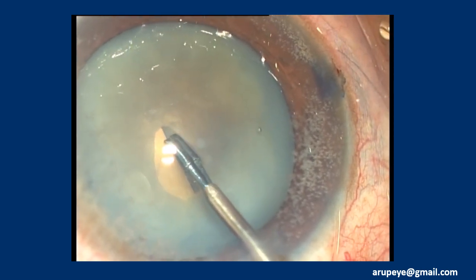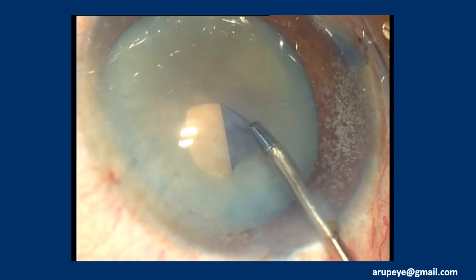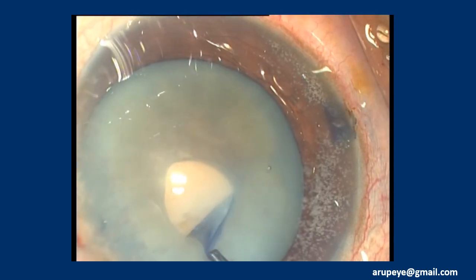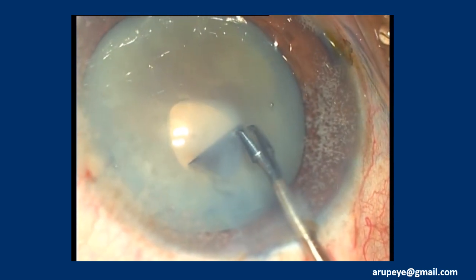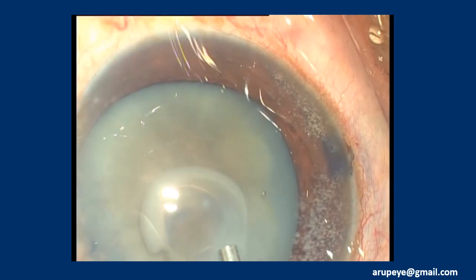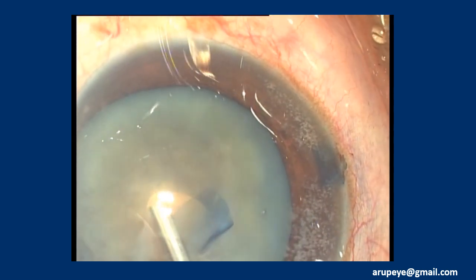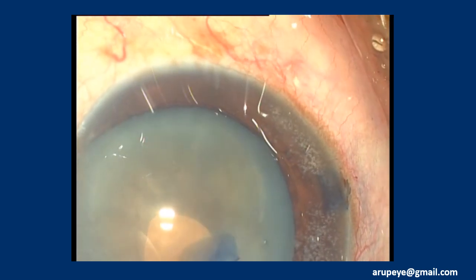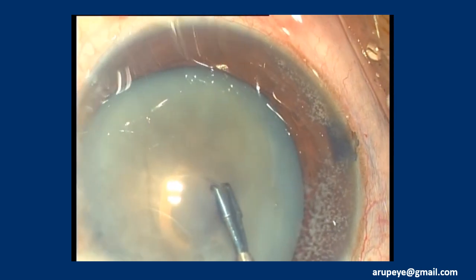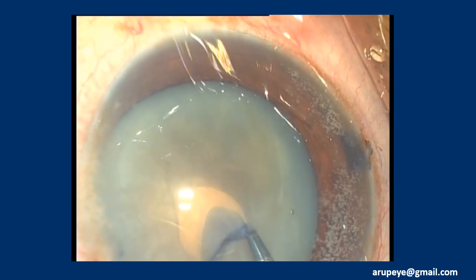The linear capsular opening is converted into a continuous geometry as a prelude to performing a definitive capsulotomy, which in this case happened as a multi-stage procedure. After the initial decompression, there should not be further risks for rhexis extension to the periphery. Like in all white cataracts, it is standard practice to have the micro forceps and micro scissors handy.